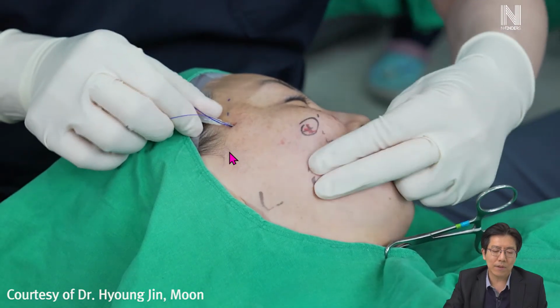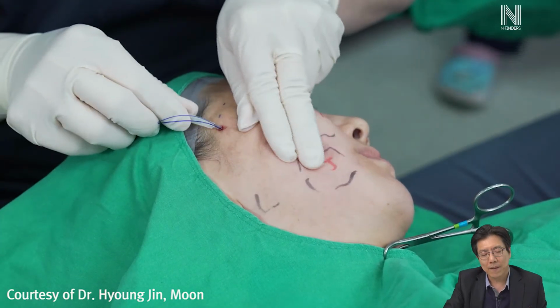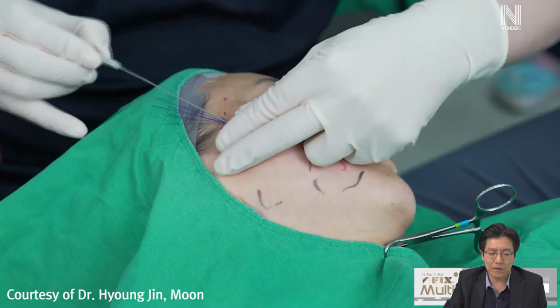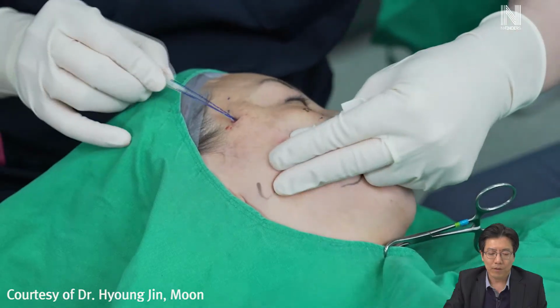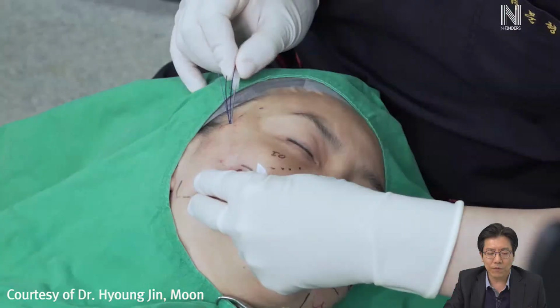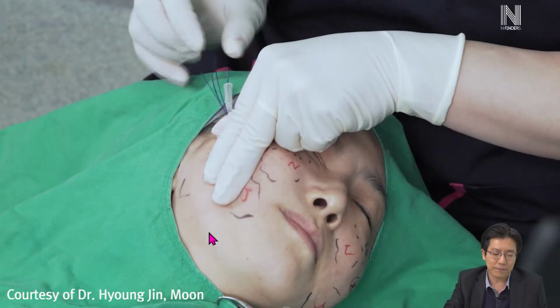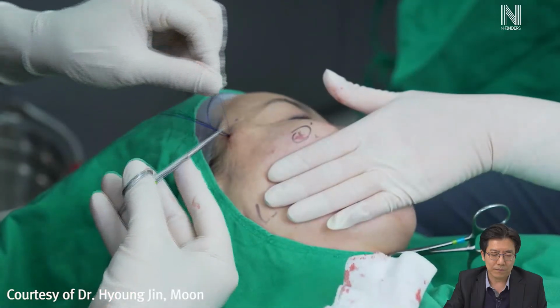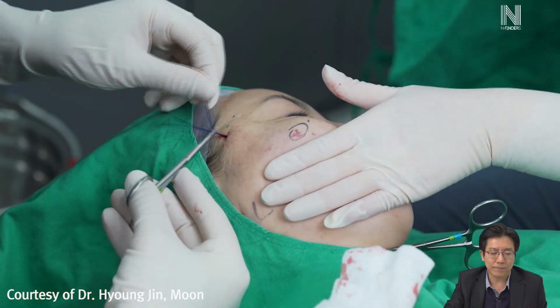These threads have a very large contact surface and very strong tensile strength, so they are ideal for this repositioning technique. So I put 4 threads to reposition the jowl fat. After that, I cut the threads one by one.